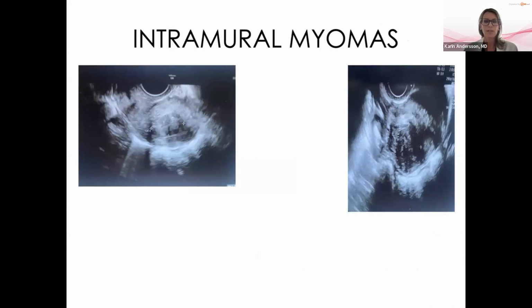We will talk about it maybe also with your questions afterwards. Someone might ask us, how many fibroids can you treat? Well, it depends a little bit upon the length of the procedure and how the fibroids are actually responding to the treatment. Because sometimes it's very, very quick, and we can also do more fibroids during the same procedure.